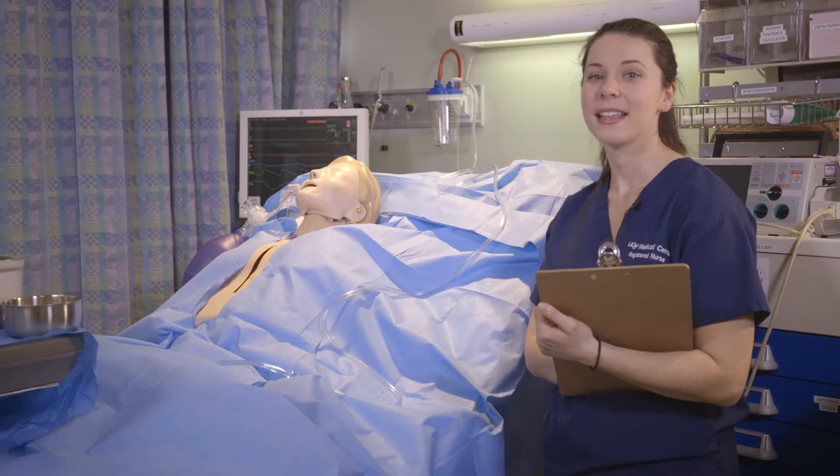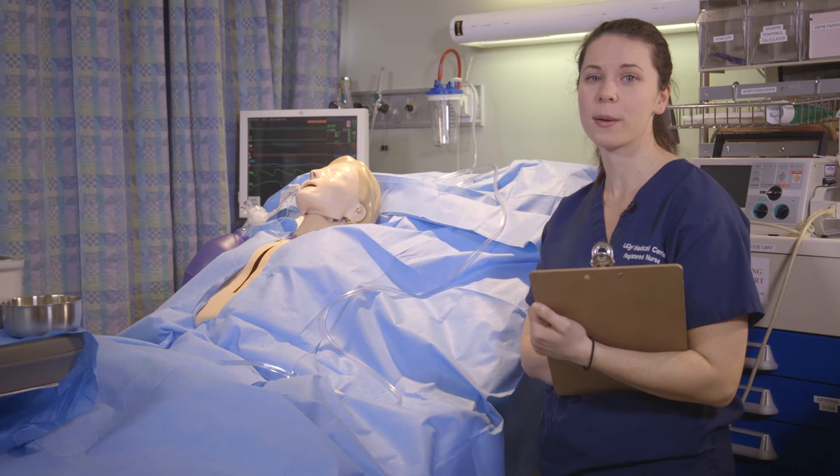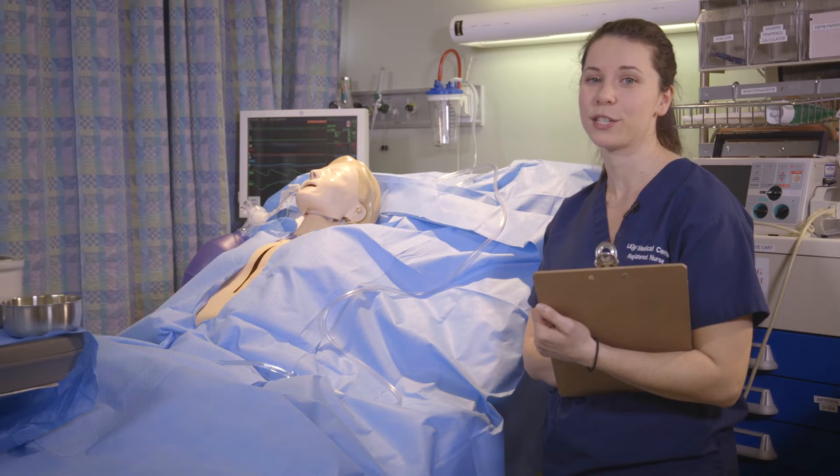It is important to remember that the bedside is now an operating room and anyone entering must wear a hat and mask. The idea is to have the room sterile and prepped for the surgeon once he or she arrives.